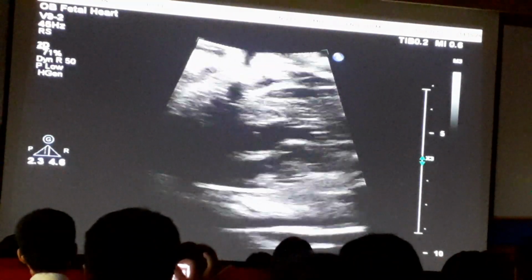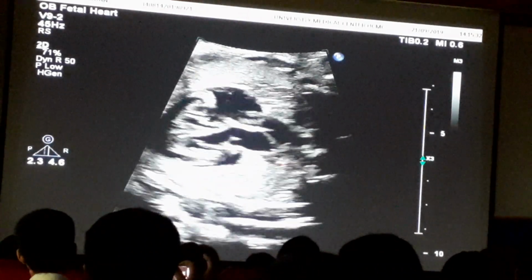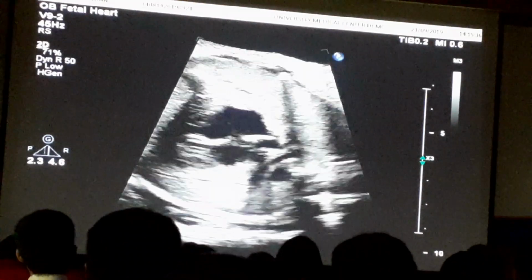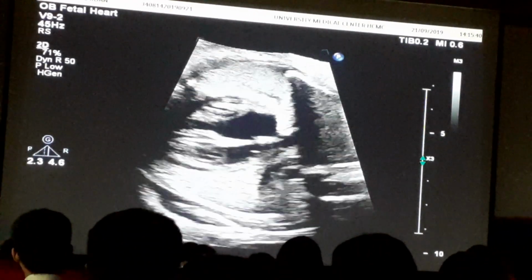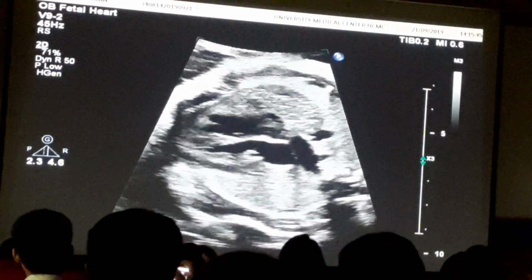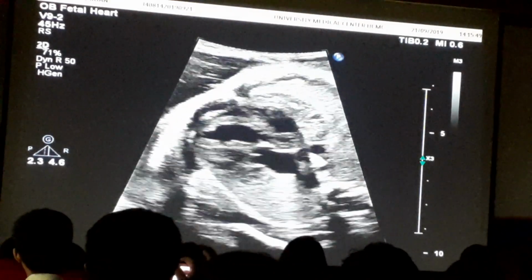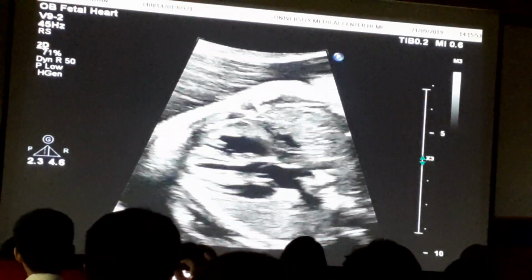The anterior one is the aorta. Phía trước là động mạch chủ, phía sau là động mạch phổi. So this fetus has transposition of the great arteries. Cái này là có chuyển vị đại động mạch rồi. The three vessel view might be expected to be abnormal, and indeed I'm having a hard time even demonstrating the three vessel view.